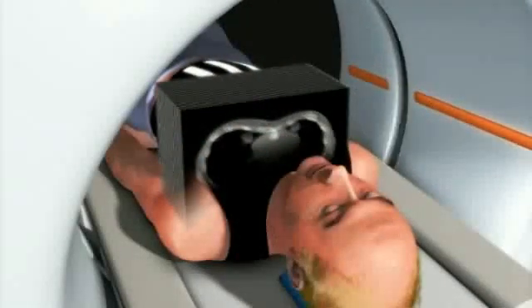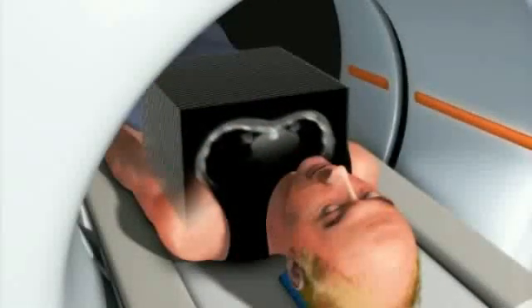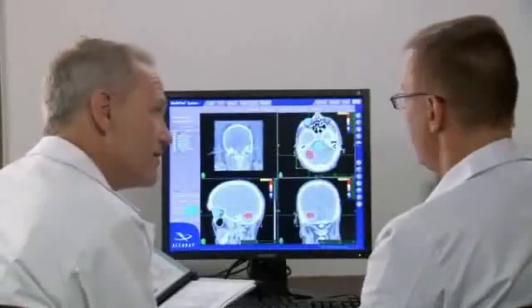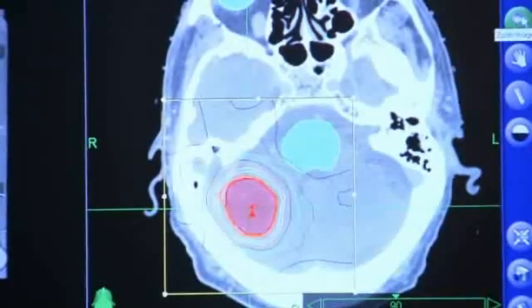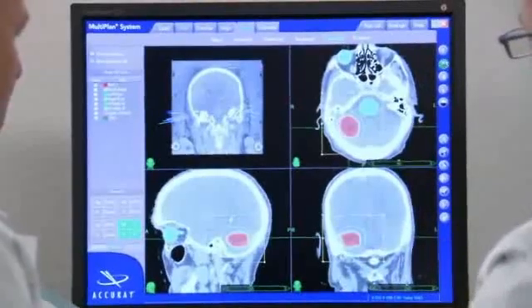While wearing the face mask, you will undergo a CT scan. This CT data will be used by the CyberKnife team to determine the exact size, shape, and location of your tumor. An MRI, PET scan, or angiogram also may be necessary to fully visualize the tumor and nearby anatomy.